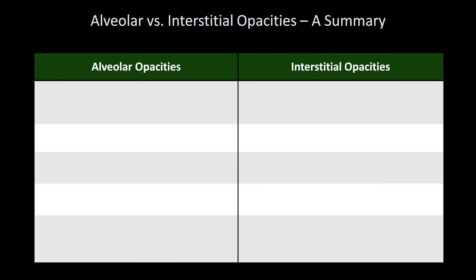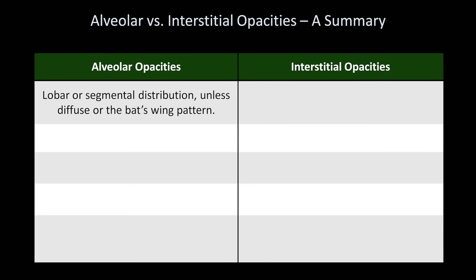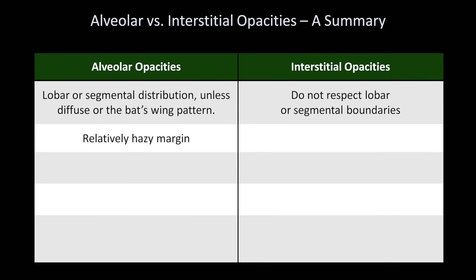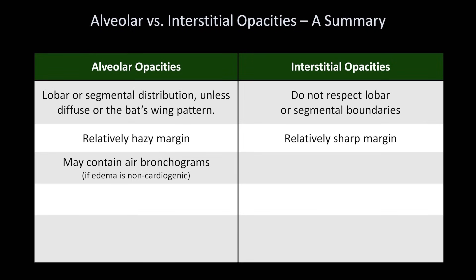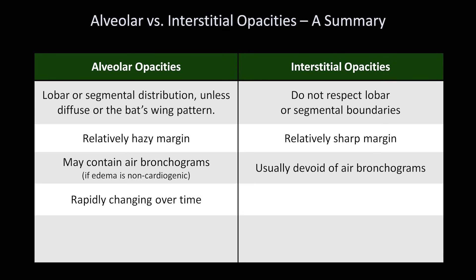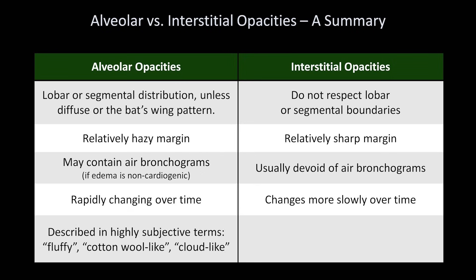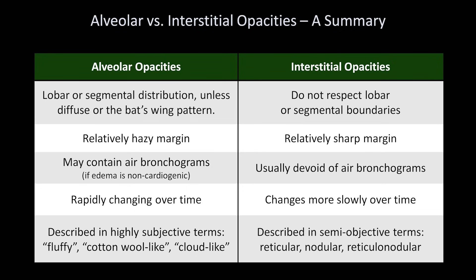To close, here is a summary comparison between alveolar and interstitial opacities. Alveolar opacities show lobar or segmental distribution unless diffuse or in the bat's wing pattern, while interstitial opacities do not respect lobar or segmental boundaries. The margin of alveolar opacities is relatively hazy, while interstitial opacities have a relatively sharp margin. Alveolar opacities may contain air bronchograms if caused by non-cardiogenic pulmonary edema, while interstitial opacities are generally devoid of them. Alveolar opacities can change rapidly — appearing and disappearing within hours — while interstitial opacities evolve much more slowly. Alveolar opacities are described in subjective terms such as fluffy, cotton-wool-like, or cloud-like, while interstitial opacities are described in semi-objective terms of reticular, nodular, or reticulonodular.